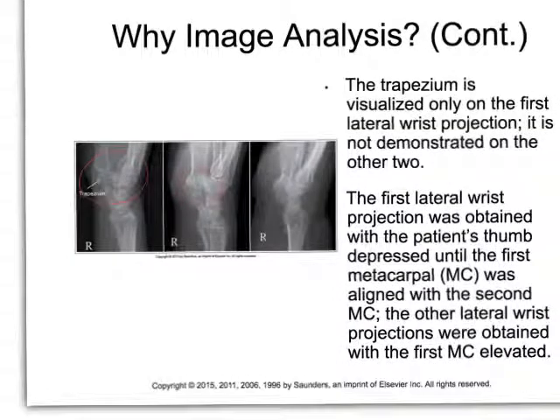So, where would this fit in our little PACEMAN acronym? Positioning. We're talking about positioning. The patient was not appropriately positioned, and so now we've obscured anatomy.